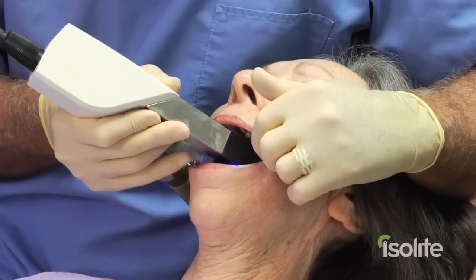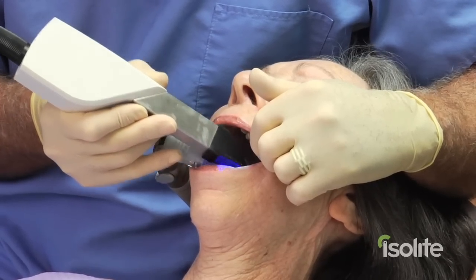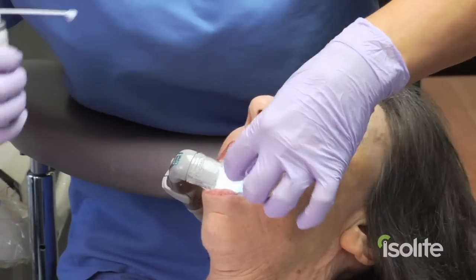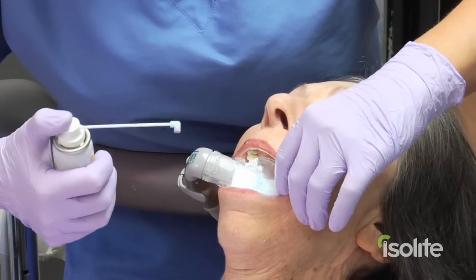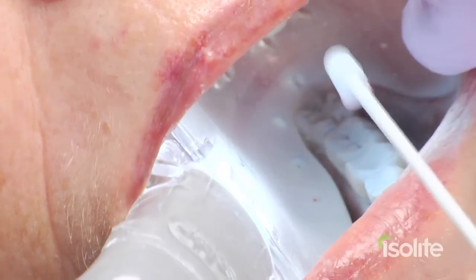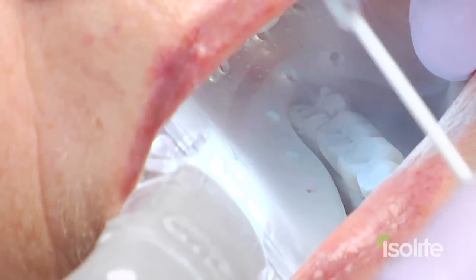As you can see, the imaging goes by very, very easily, very rapidly, because you don't have to worry about the tongue getting in the way. Your assistant can take over and do the spraying while you're in the other room working, so she can get a lot of preliminary stuff taken care of — she can work by herself.